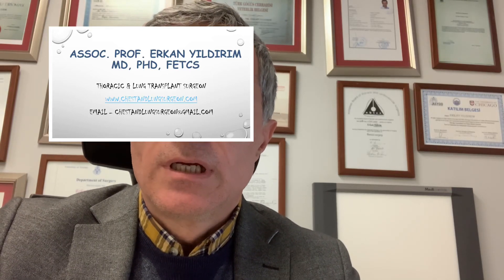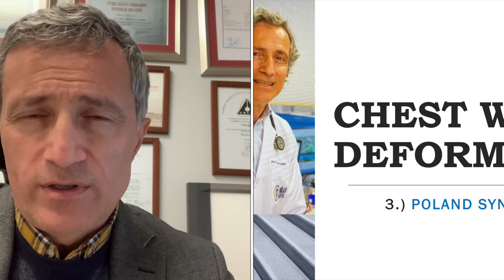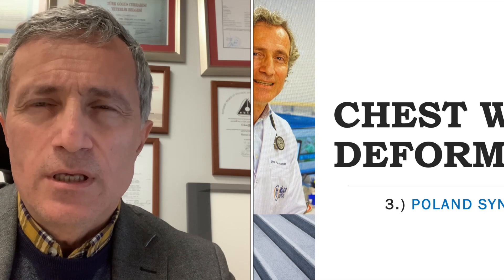Hello everyone. I'd like to talk about the Poland syndrome treatment method — the 3D customized implant for the missing part of the pectoralis major muscle, the mammary muscle.